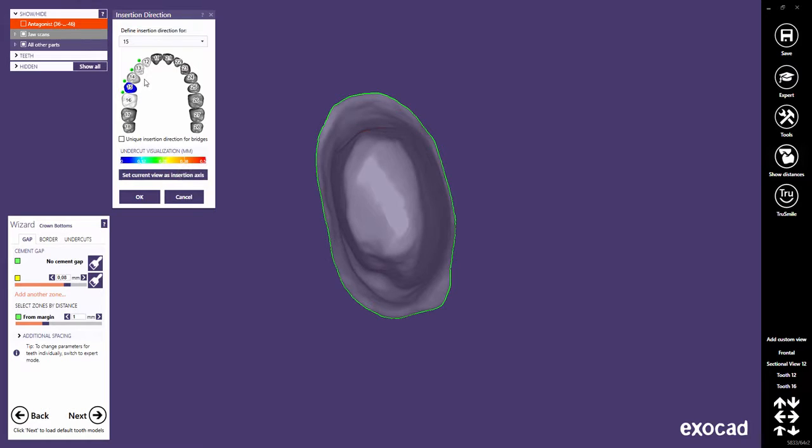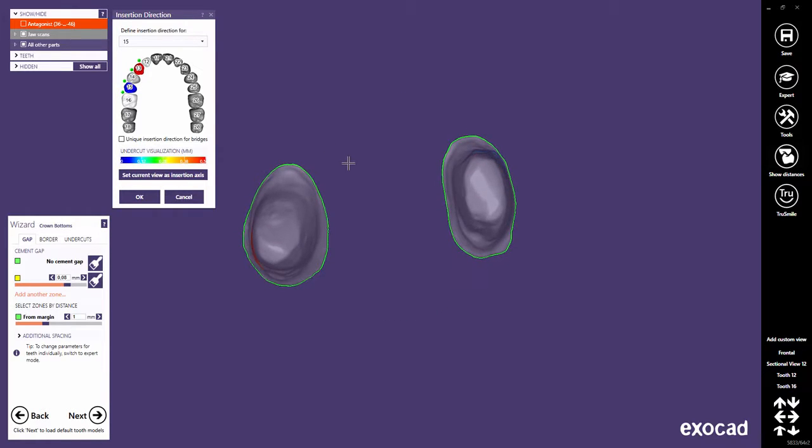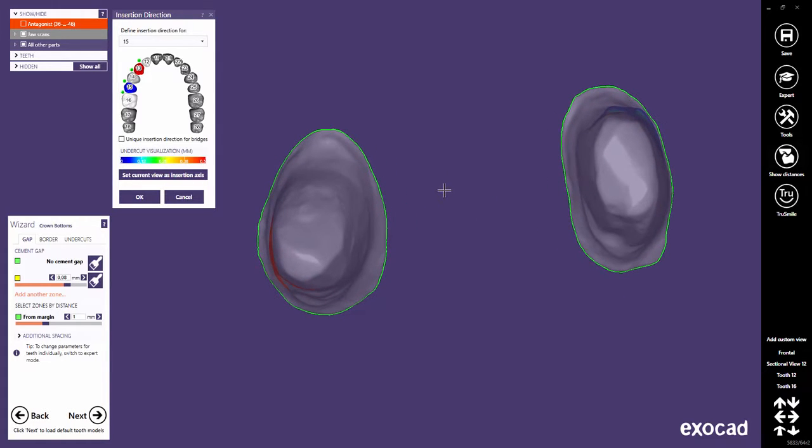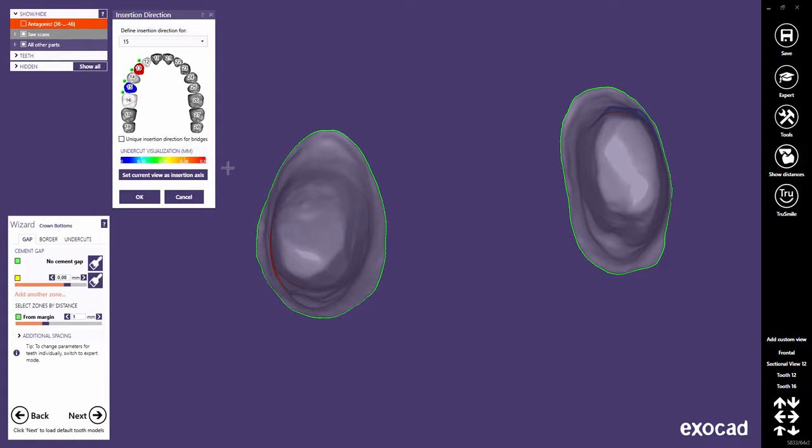In the tooth bow, you can select a series of teeth with a click to define a unique insertion axis for those. Click Set Current View as Insertion Axis to define a unique insertion axis for the selected teeth.